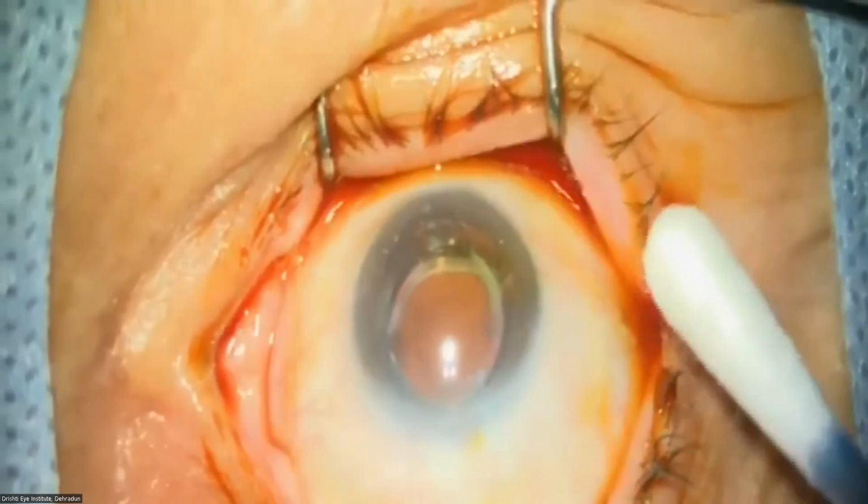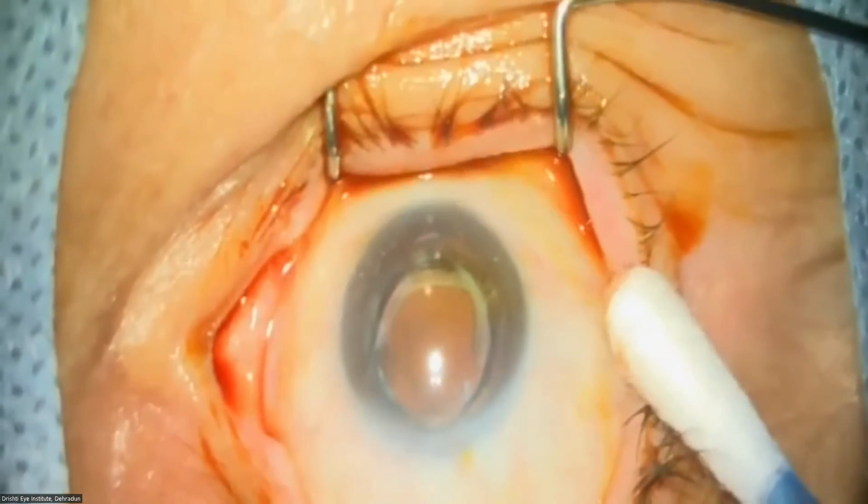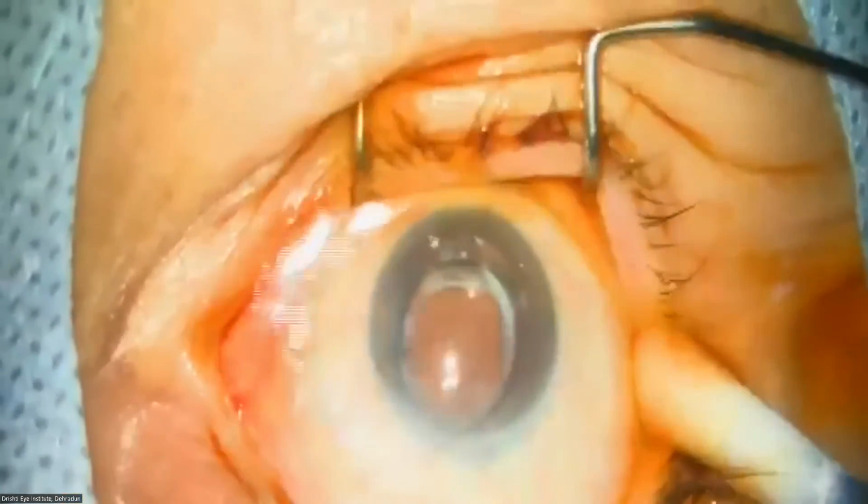So first, the assistant has already put betadine on the lid. So I just wash that off.